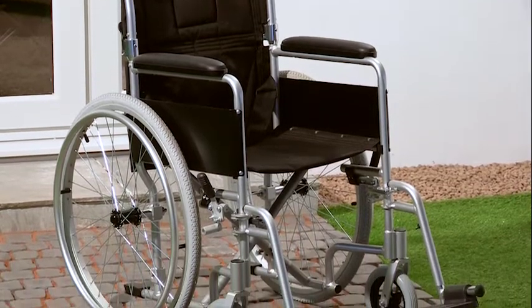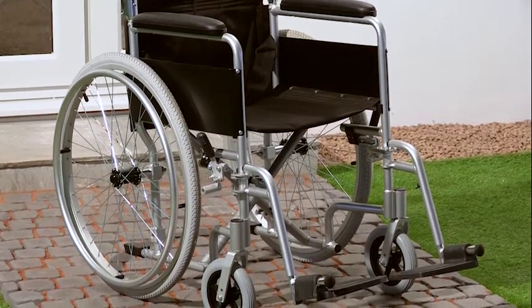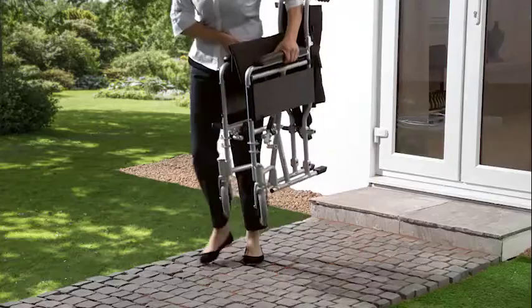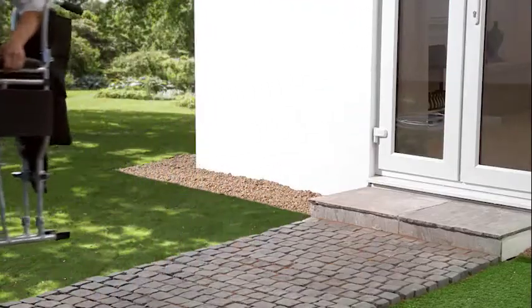With this wheelchair being made from aluminium, it is really very light. In fact, with all quick-release items removed, the carry weight is only 8.5 kilograms.